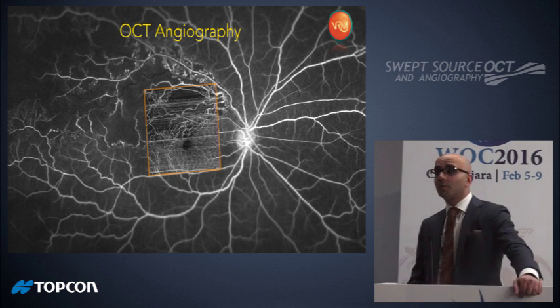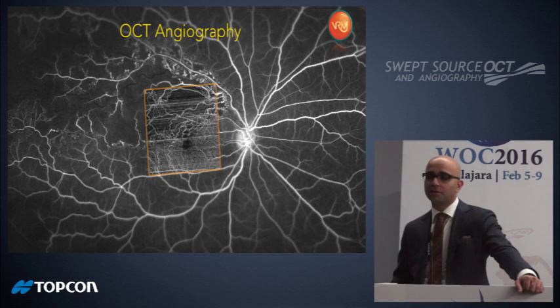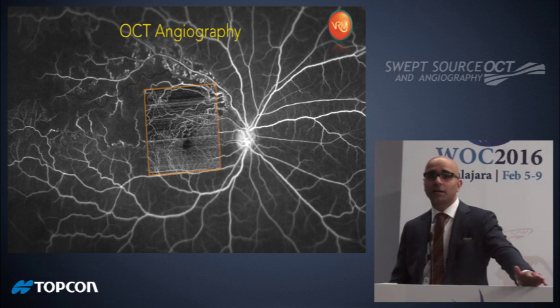So one thing to keep in mind, as was pointed out by Voss earlier, of course, is that OCT angiography is part of the picture. This is an example of a 6 by 6 millimeter slab. And those of us who are using ultra-wide field angiography would probably agree that angiography is not dead yet, but OCTA is one piece of the overall puzzle.